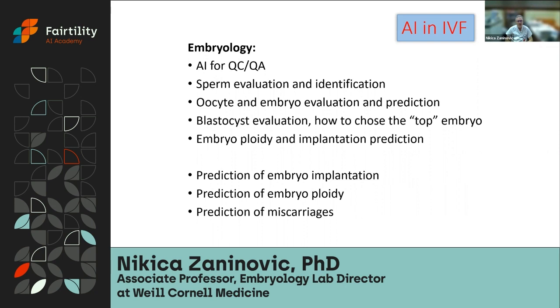Starting from embryology, we can include AI in quality control and quality assurance, evaluating sperm and identifying sperm in some difficult cases, evaluating and predicting oocytes and embryos, trying to figure out which is a top embryo or top blastocyst within the cohort of each particular patient to minimize time to pregnancy.